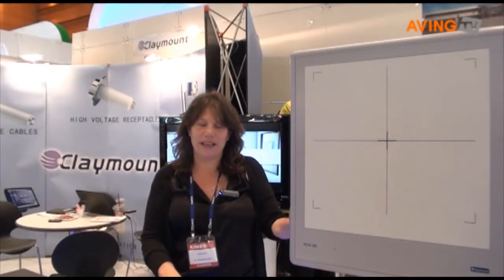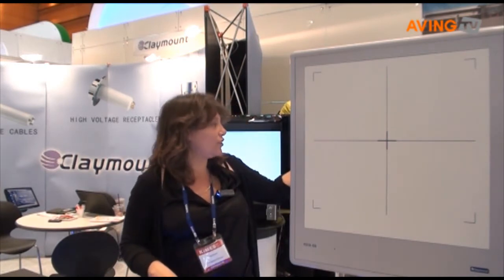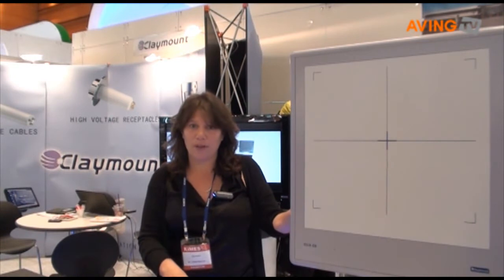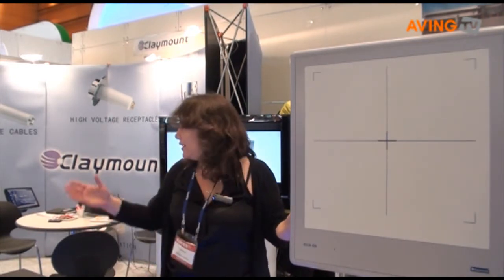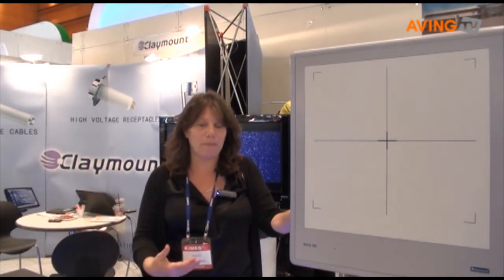Hi, this is Claymount. We're a one-stop shop for x-ray components. We offer everything from the high voltage cables all the way up to this end-user product, a full upgrade retrofit kit for digital radiography with two buckies. We have a digital mammography system, collimator generator. We're very happy to offer all these components to OEMs and distributors in Korea and the whole world.